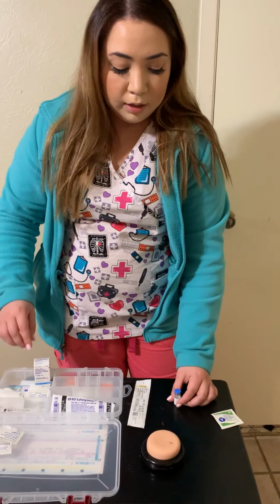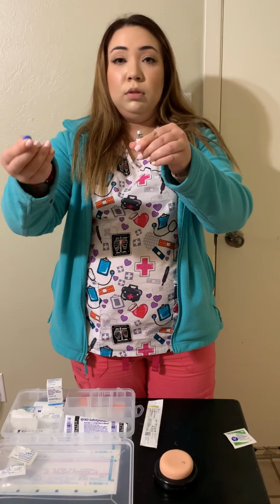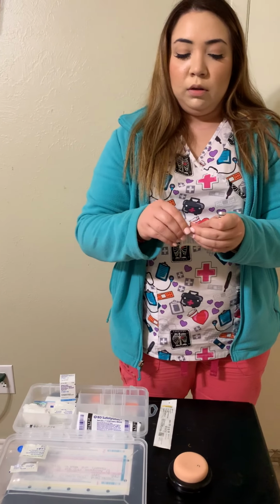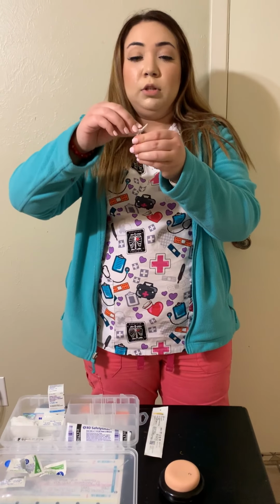Then I'm going to take my vial of solution. This is a new vial, so I'm going to take off the cap. And with another alcohol pad, I'm just going to scrub the top.